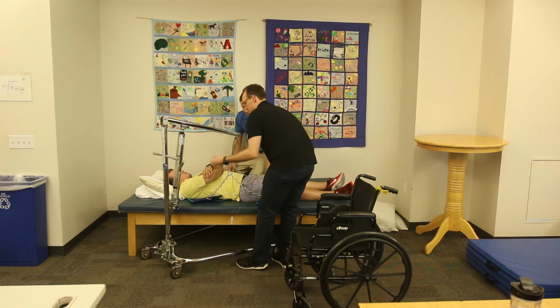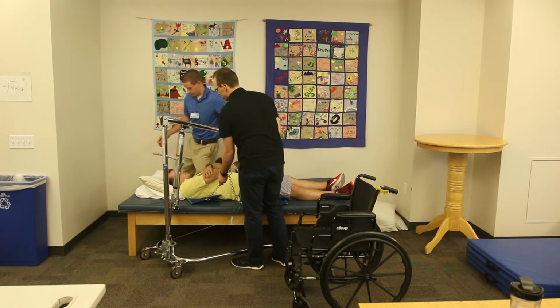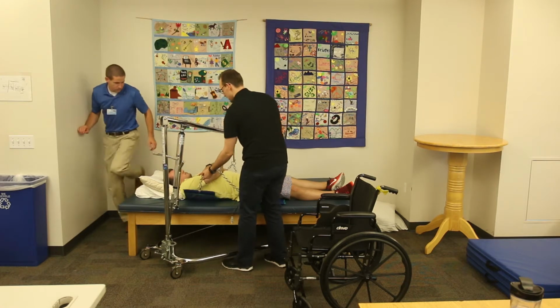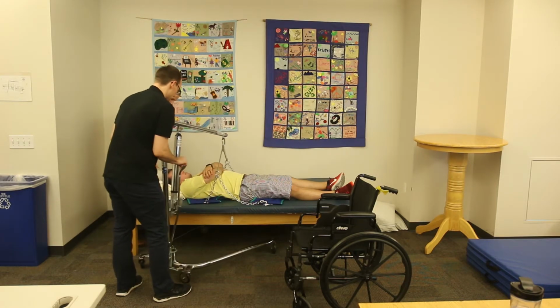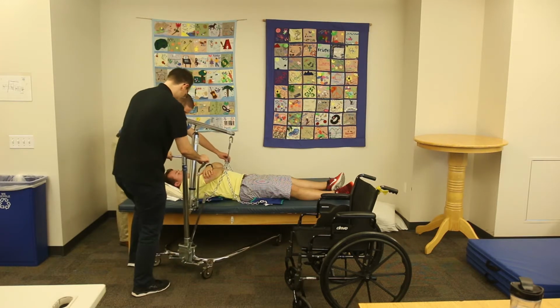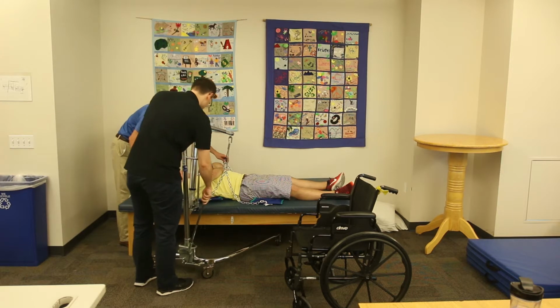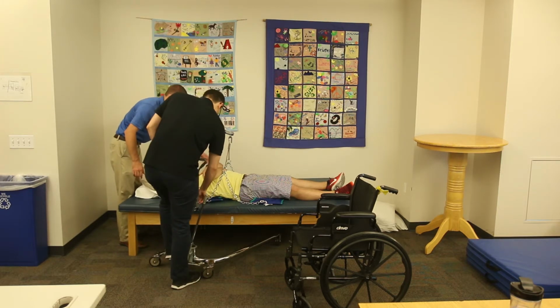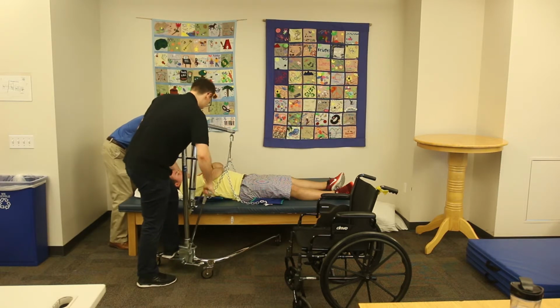All right, Dylan, so I'm gonna raise the Hoyer. I want you to help position Richard's head and neck. Just make sure it's secured. And we might have to scooch this back a little bit more. I'm gonna position this too. So I'm gonna lock the Hoyer before we get going. You ready? Yep, let's go. All right, you're gonna come up here.